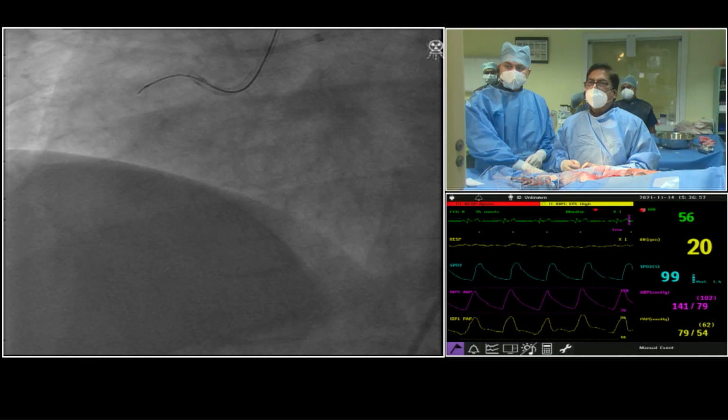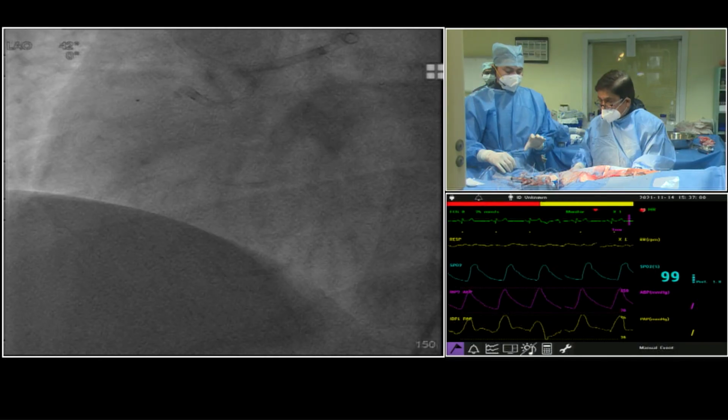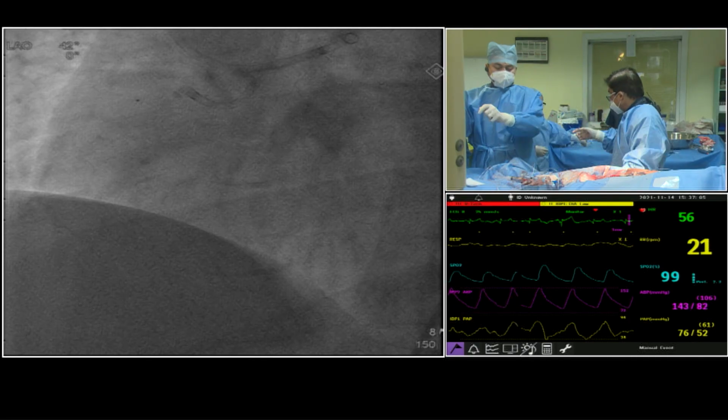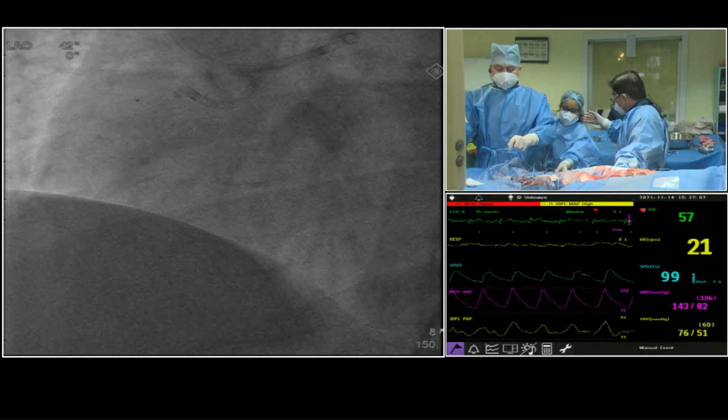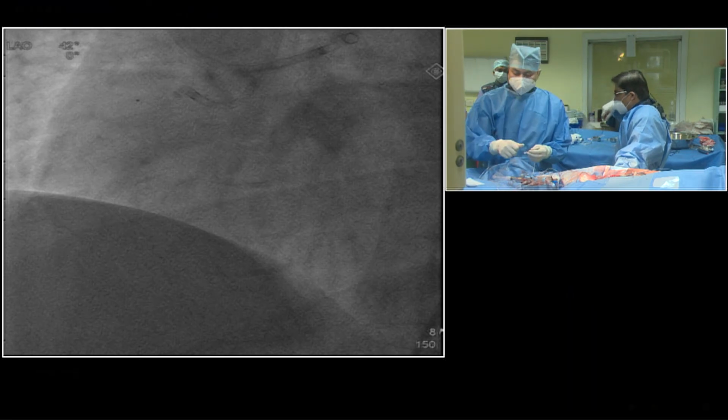Yeah, sure. What about AR catheters? This has become a tough occlusion actually. I thought it was soft. It is not so. So what I need is a Gaia 2 or Conquest. Gaia 2, you have? Dr. Goel? Give me Gaia 2.